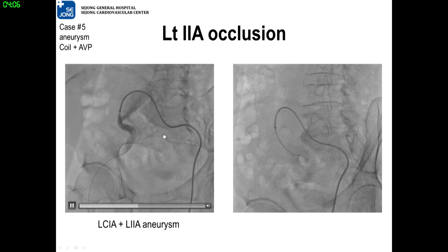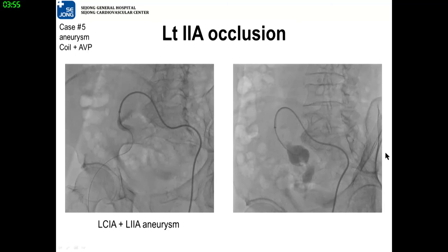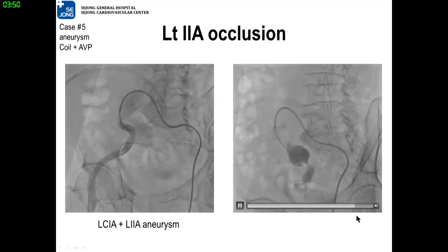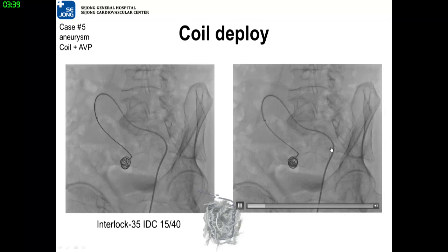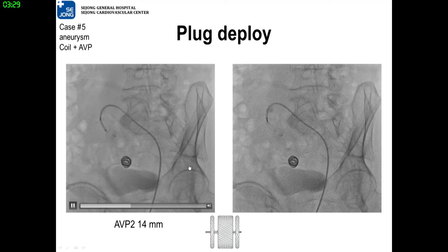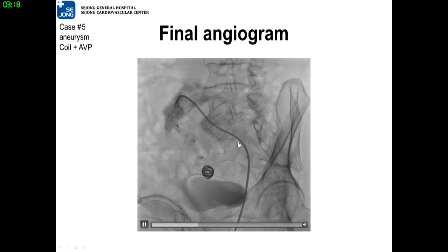You can see both common iliac artery aneurysm and internal iliac artery aneurysm. We need to occlude both the inlet and outlet of the internal iliac artery aneurysm. For the outlet, a detachable coil — Interlock — is used. And for the inlet, AVP-2 plug is successfully deployed. Now you can see the embolization is successful.